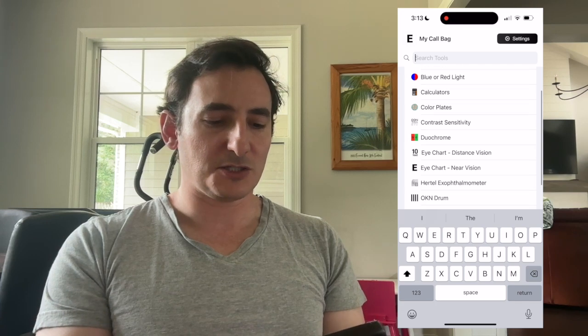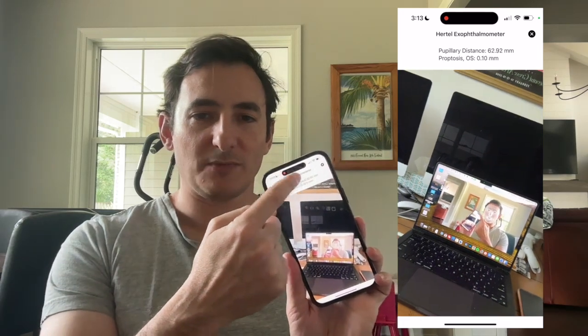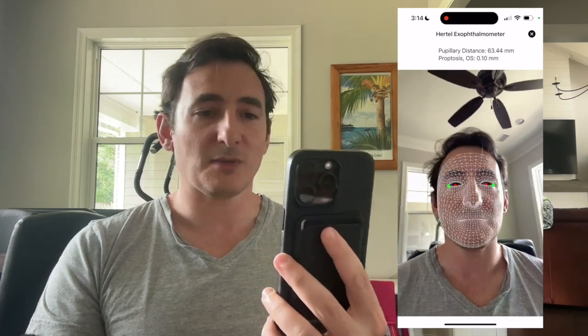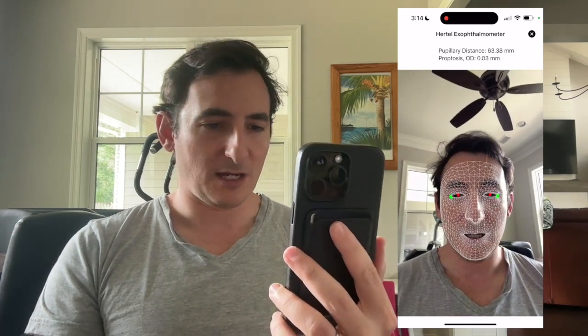I'll launch it here. What the Hertel Exophthalmometer does is it uses the TrueDepth camera to recognize your face, and it overlaps your face with a geometric grid overlay. This is the same technology that Apple uses for Face ID, and as you can see in real time, it is mapping the contours of my face. The green dots are supposed to recognize the lateral orbital rim, or lateral canthus of each eye, and the red dots show the pupil.